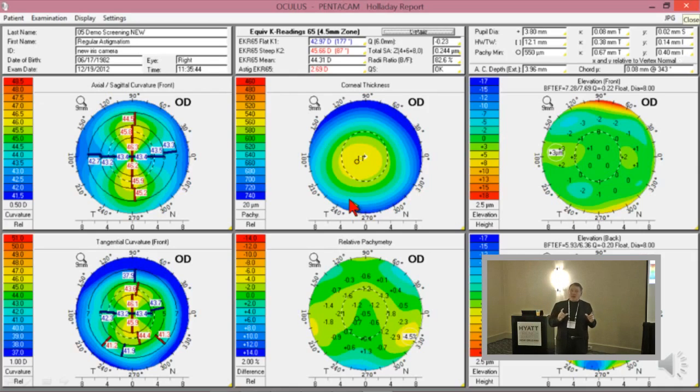The true net power is the 44, 1 diopter less than that 45. So in the study that they did on the ASCRS website, Rick Kotkin, when he put that number in, took the 44, and it turns out that for post-refractive surgery patients, a 44 number is a value that's better than you would use on a normal patient, because we usually overestimate the power of a cornea in somebody that's had myopic LASIK.